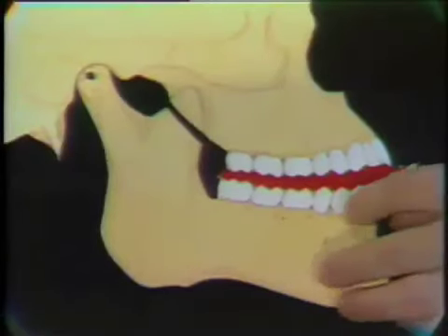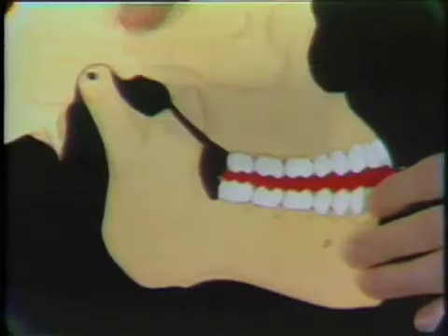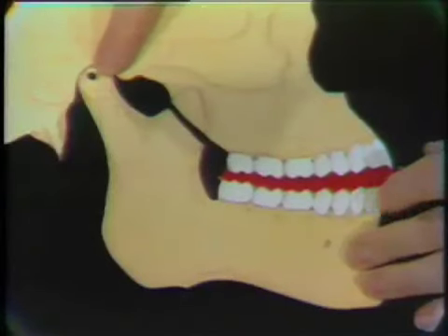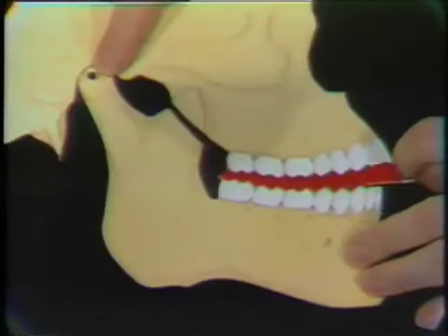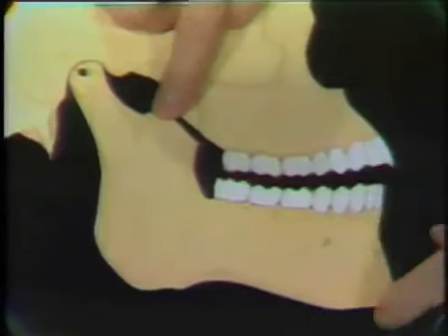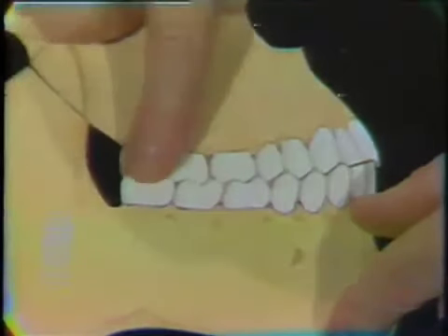If we have here our centric relation registration between the teeth and we have the correct hinge axis, we should be able to take the centric registration from between the teeth and have the teeth close down into their normal contact relationship, or the same way as they would be in the mouth if this were the articulator. You can see that the teeth are in good contact relationship.